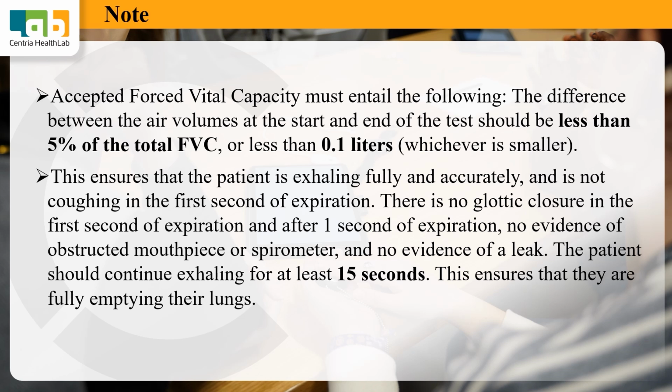This ensures the patient is exhaling fully and accurately and is not coughing in the first second of expiration. There is no glottic closure in the first second of expiration, and after the first second of expiration, no evidence of obstructed mouthpiece or spirometer, and no evidence of a leak. The patient should continue exhaling for at least 15 seconds. This ensures that they are fully emptying their lungs.